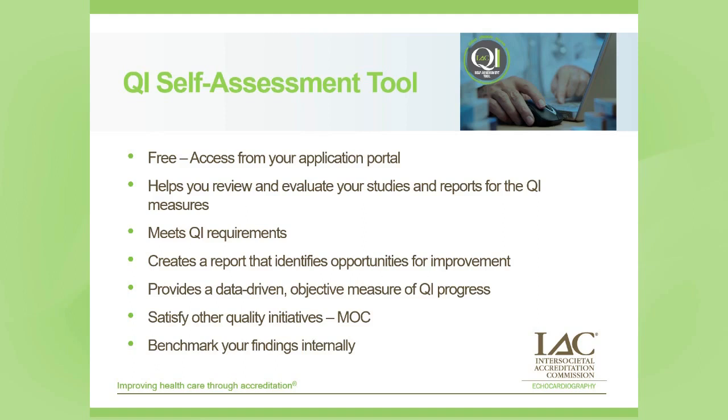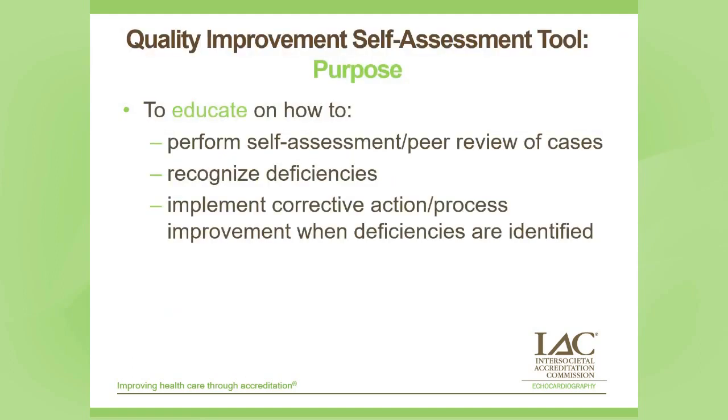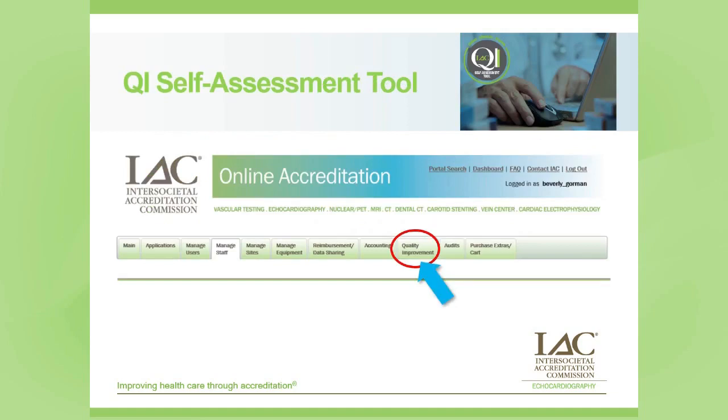The QI tool is also great for training new staff. You can evaluate their work along with them, and then it gives you opportunities of improvement for that. The purpose, of course, is to educate how to perform a self-assessment and a peer review of your own cases. It will allow you to recognize deficiencies and also implement a corrective action plan or a process improvement when you do identify these deficiencies.